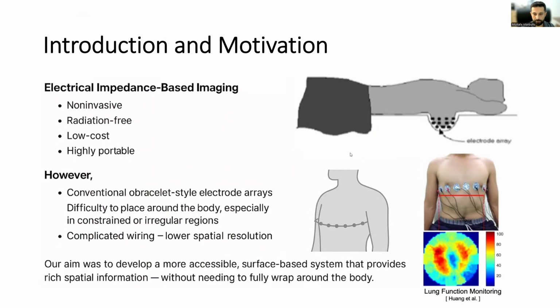Let's begin with some context. Accurate and non-invasive imaging techniques play crucial roles in diagnosing and monitoring various medical conditions, offering safer alternatives to conventional methods. Bioimpedance measurement provides a practical approach to assess internal structures by injecting an alternating current into the sample under test and measuring the resultant voltage distribution.